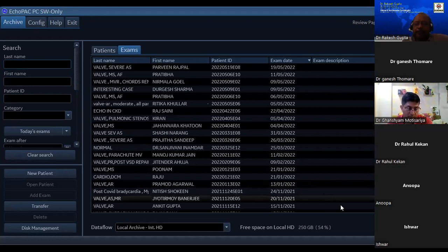Sir, one question. Go ahead. Sir, how to differentiate between a blob of calcium and a vegetation, echo wise? No, it's not possible. Okay, sir. So, all right, let me move on to aortic stenosis from mitral stenosis.